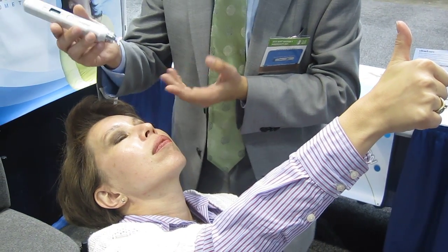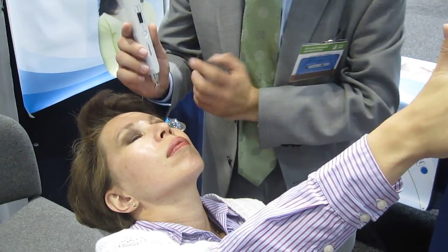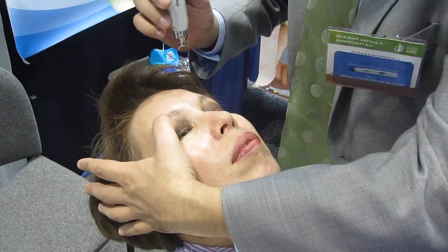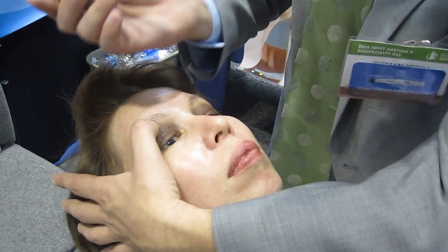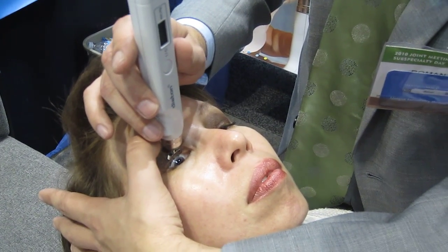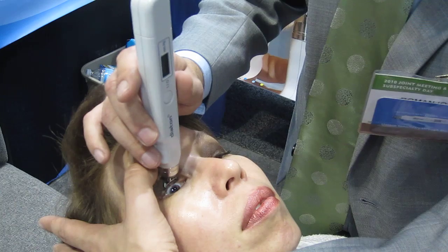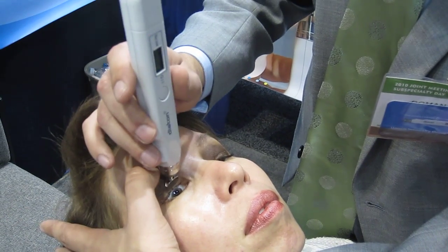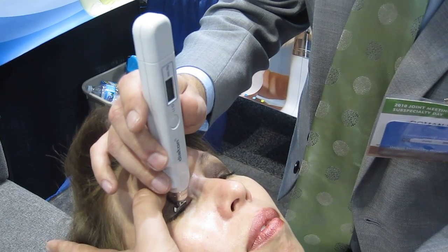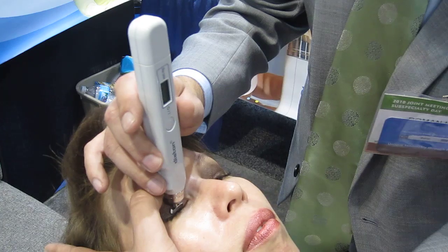Get the tonometer into working condition. Here I use the index finger to pull on the eyelid, then go around the patient's face and use the thumb, gently pulling it upwards. I use the edge of my palm for support. Place the tip of the tonometer right over the tarsus. Make sure it's in a vertical position and not sliding onto the cornea. Take the first and second readings, making sure the lid does not slide onto the cornea — we want to be above, ensuring the reading is done over the sclera, not the cornea.